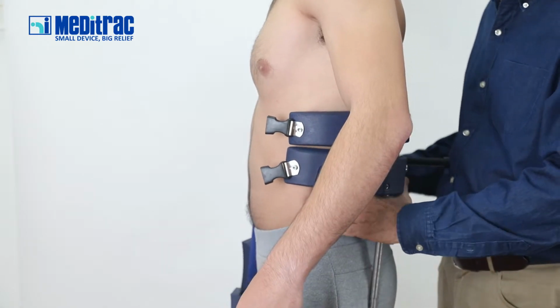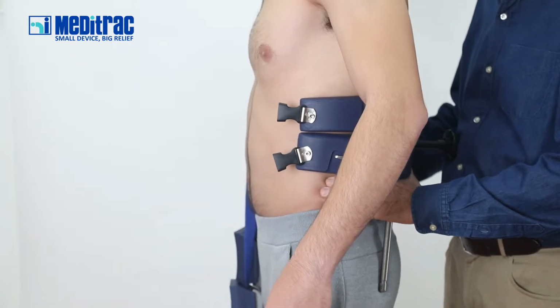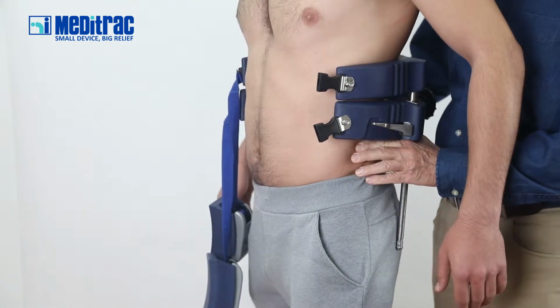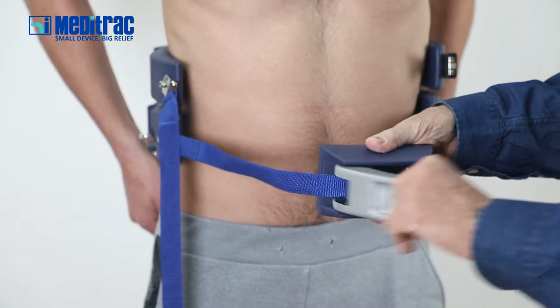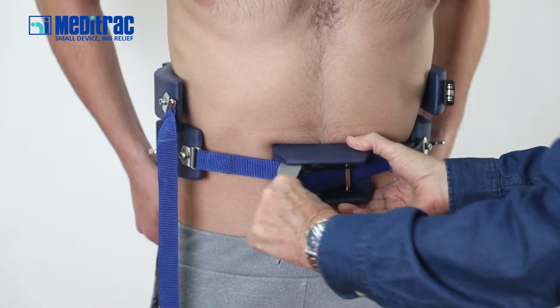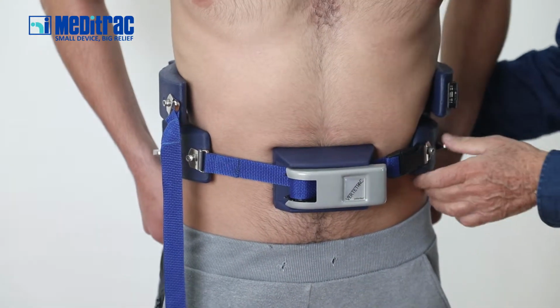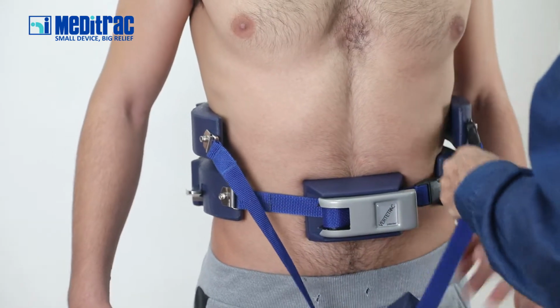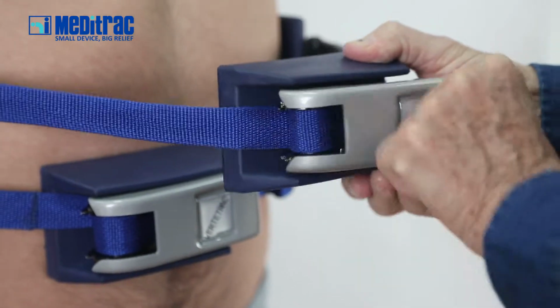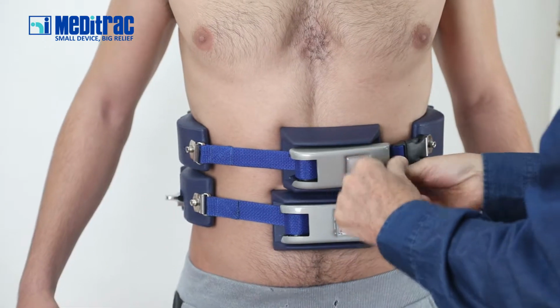With the patient holding the lower frame, place it directly above the iliac crests, pelvis, with the horizontal force screw centered behind the spine. When the Vertetrac is properly positioned, fasten the lower belt fastener and begin tightening the lower ratchet so that the ratchet rests loosely in the middle of the patient's body. Tighten the belt by moving the ratchet handle in a left-to-right motion, repeating until the appropriate amount of tension has been applied. Do the same for the upper belt fastener.